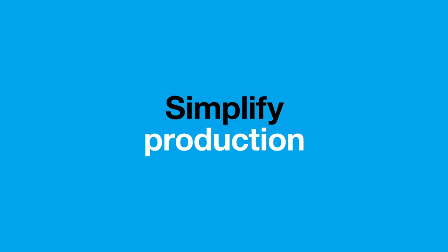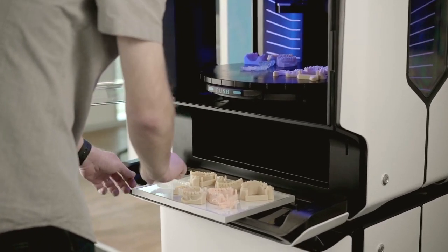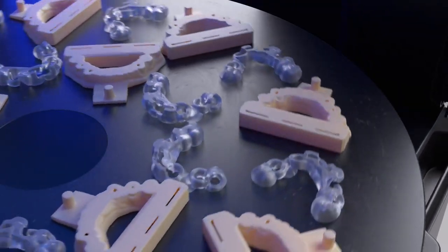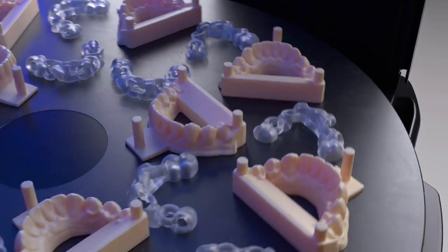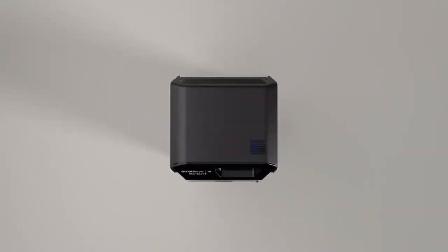Simplify your production and maximize throughput with precise, unattended mixed tray printing. Our 360-degree rotating build tray allows you to print in multiple materials at the same time, giving you maximum output in the smallest of footprints.